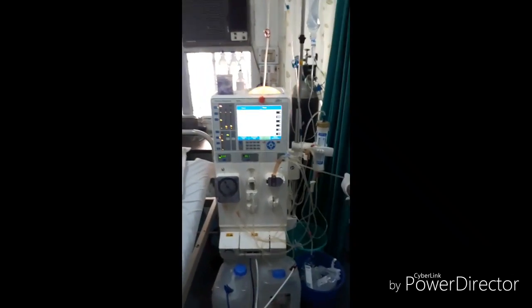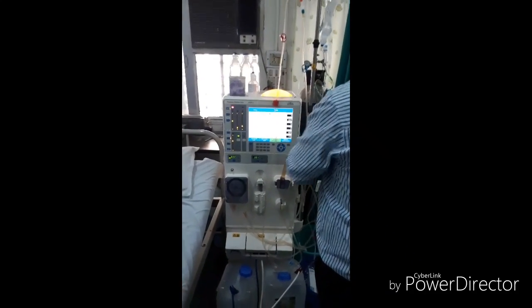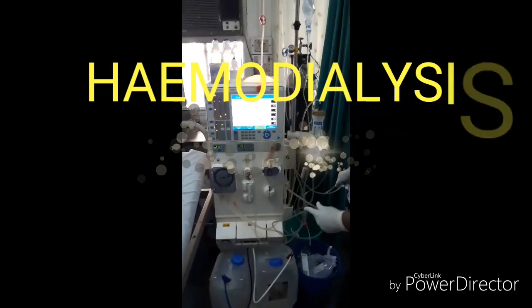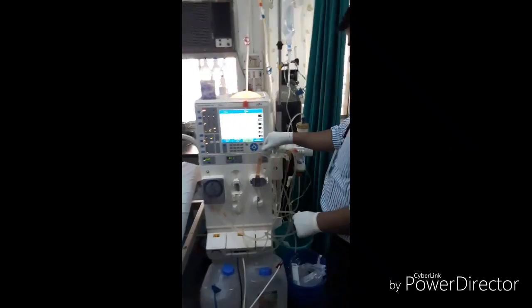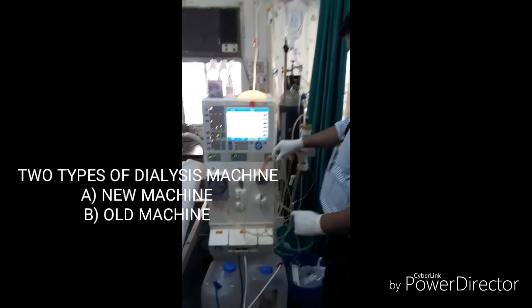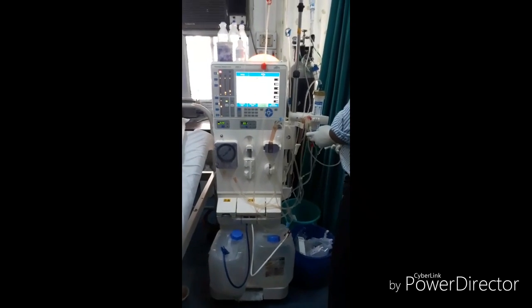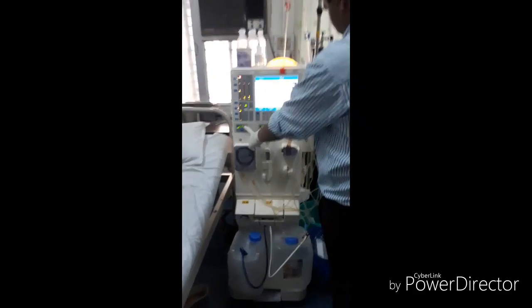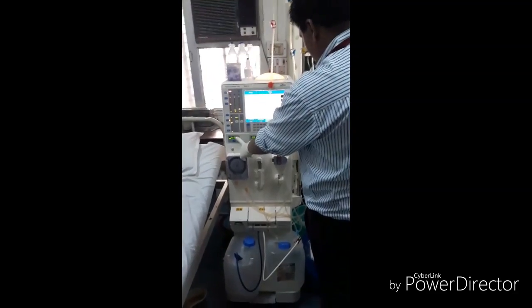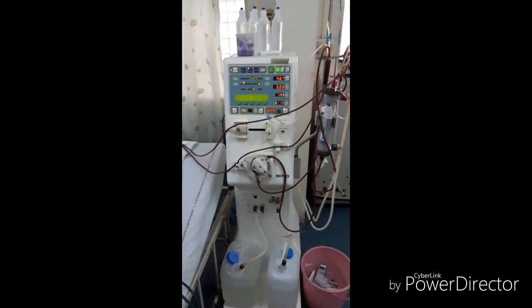In this video we are going to see a machine called the dialysis machine. By using this machine — is machine ka istamal karke — we are going to do hemodialysis. There are two types of dialysis machines: the one shown first is the newer version, and the second one is the older version.